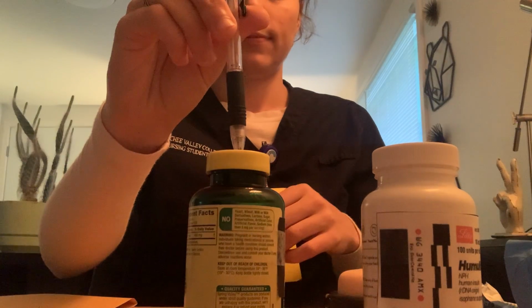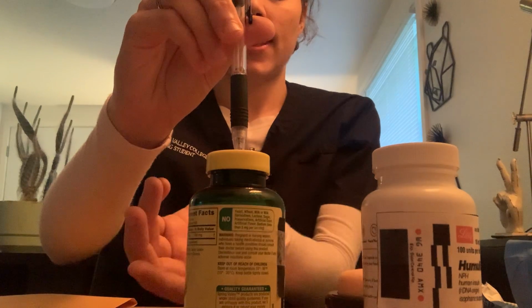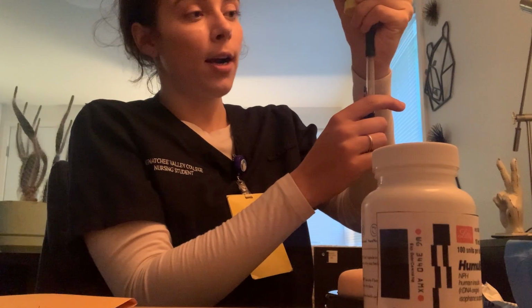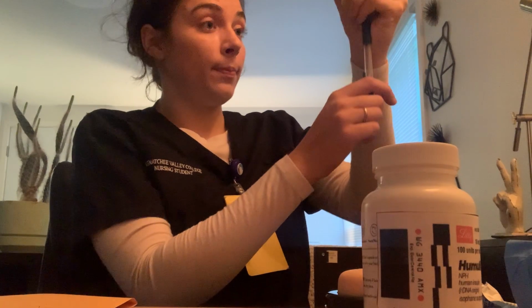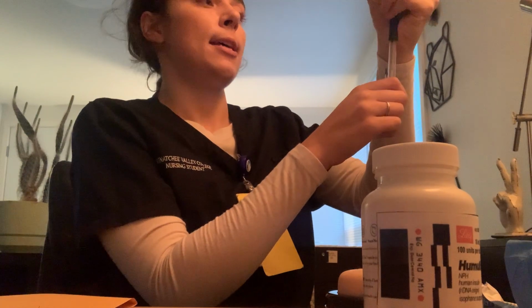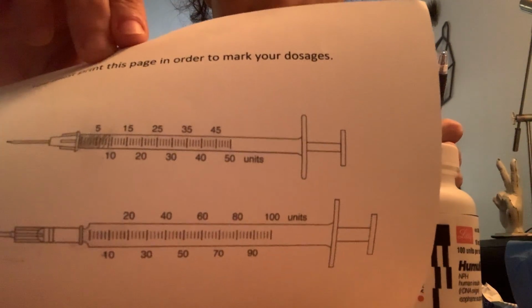Draw back 6 units. Inject the air. But this time, we are going to invert the needle and pull back our 9 units. 9 units altogether. So I would have aspirated 9 units injected. I'm going to pull back 9, ensuring there are no bubbles. You can flick the vial. I'm going to have my second RN come in verify dosage, which is going to be represented on that first insulin syringe.